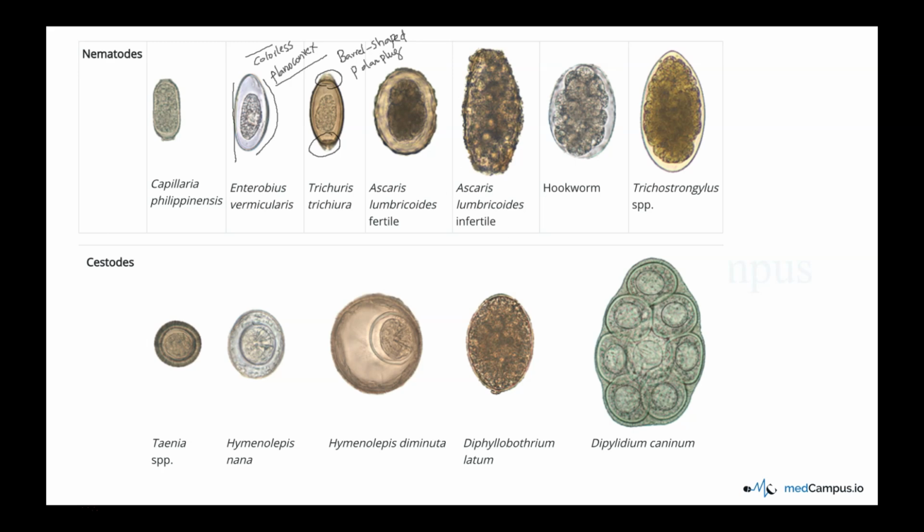Next thing which we will be looking at is hookworm. We'll finish off hookworm, then we'll come back to the Ascaris part. So next is hookworm. Hookworm, both the eggs you cannot differentiate them. Okay, both Ankylostoma and Necator americanus, they both have the same feature.